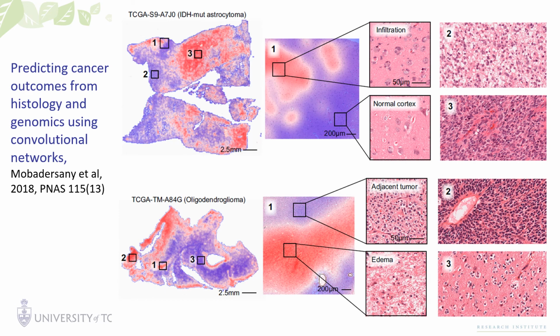And the reason these survival models are attracting so much interest is because once you've trained a survival model to predict outcome based on the whole slide image, you can then start to decide what part of the image drove that decision. So here, this is a survival model that's been trained on whole slide labels, but then they've applied that model to individual patches within the slide. So you now get a heat map where the temperature of the heat map reflects the probability of death. So an area that's bright red is a very aggressive part of the tumour, or that's the assumption.